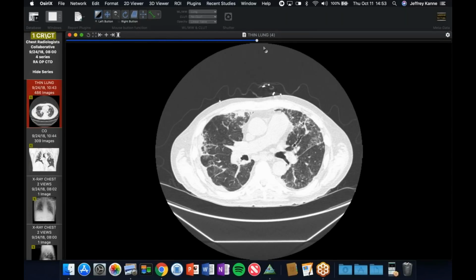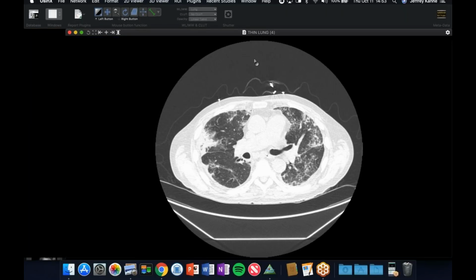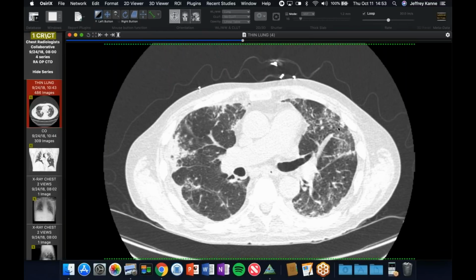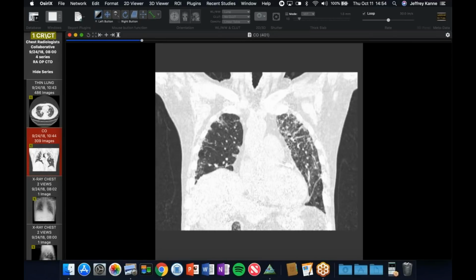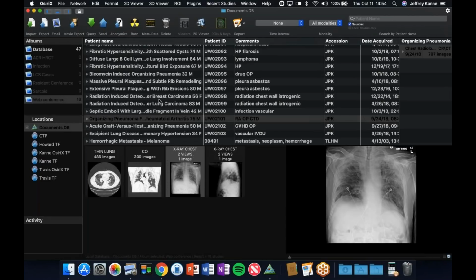And you look at the CT, and it's going to show you exactly what you see on the radiograph. But this peripheral multifocal consolidation, ground glass, very discrete areas, a nice example of non-segmental involvement where it just goes right across the pulmonary fissure. Doesn't care that it's there. So another organizing pneumonia pattern. He does have some heart disease, probably explaining the pleural effusions, and then the coronal doing this. This would be a classic case of chronic eosinophilic pneumonia based on what's written. But in this case, this is all organizing pneumonia from his RA, and the rheumatologists determined that was the cause, and so they have to find some alternative drugs to manage that.